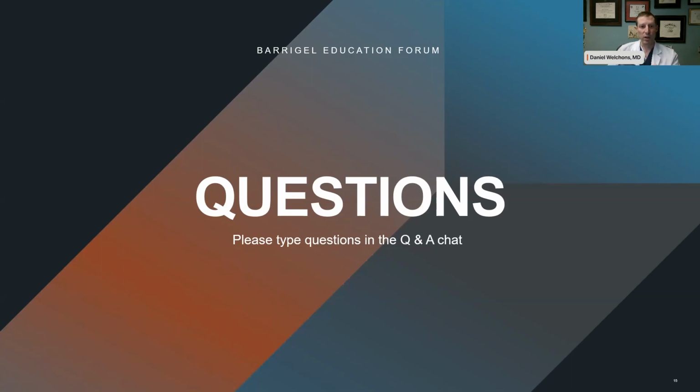Another question is, when you started as a new user, how did you get your staff on board and educate them? I kind of mentioned that tonight during the webinar about what it takes. It's relatively easy, and pretty surprising how quickly the nurses picked it up. It's really just handing me a needle for the most part, and having some lidocaine up, and putting the patient in stirrups.